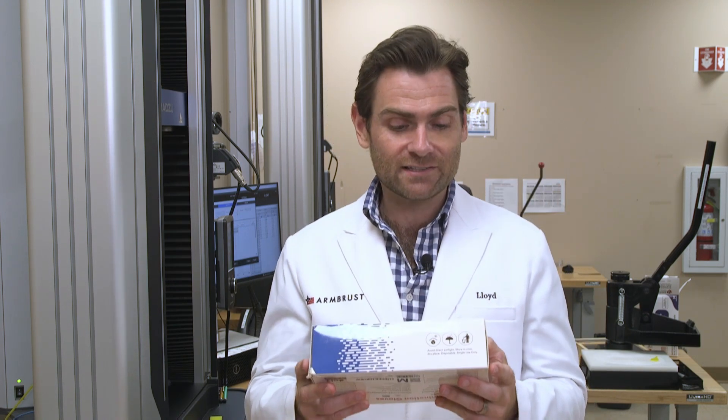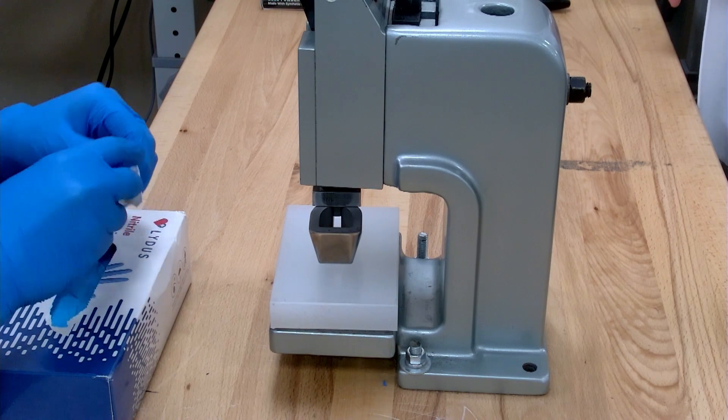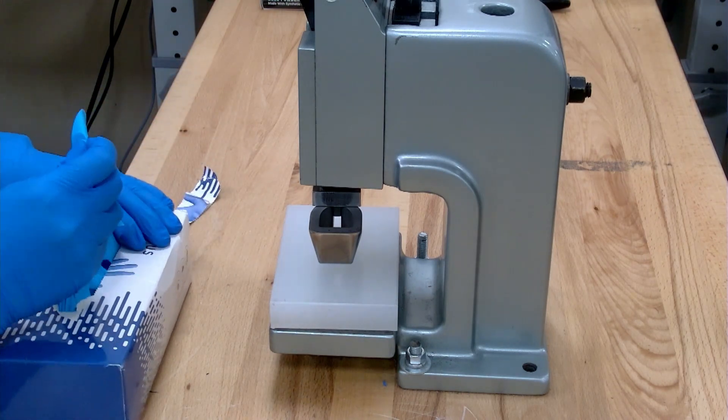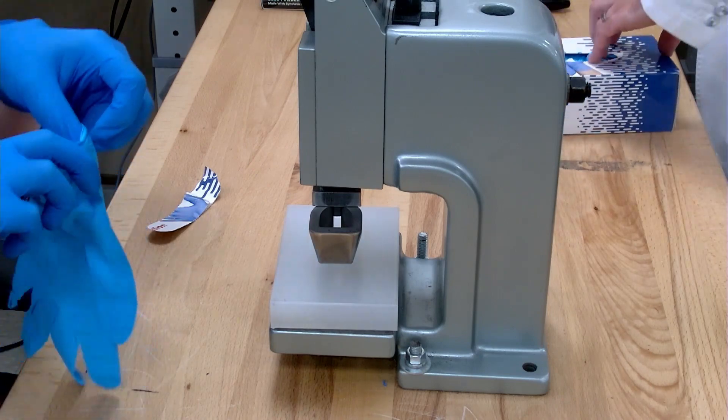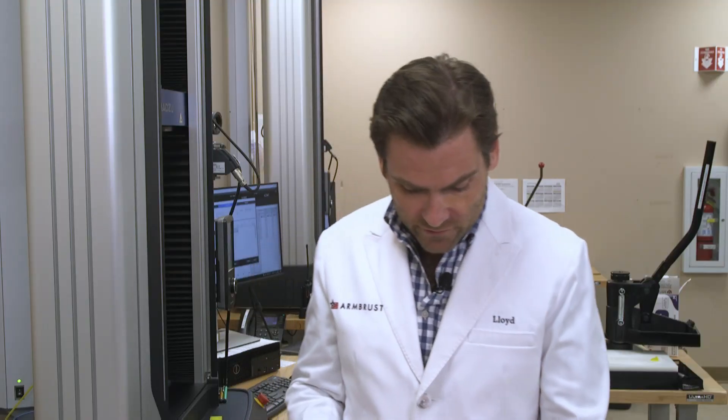Today we're looking at the Lydus Nitrile Examination Gloves and Tara is going to open this up and cut a small piece out of the exam glove. This is going to allow Chris to test on this very fancy machine, which we'll show you in a second.